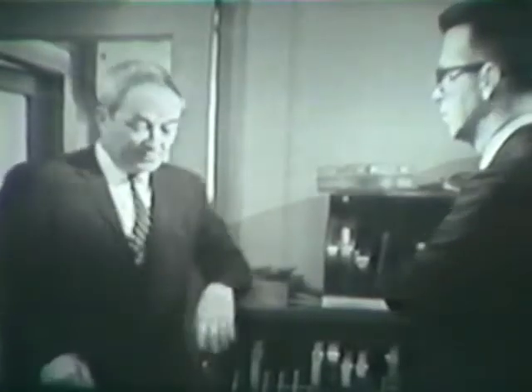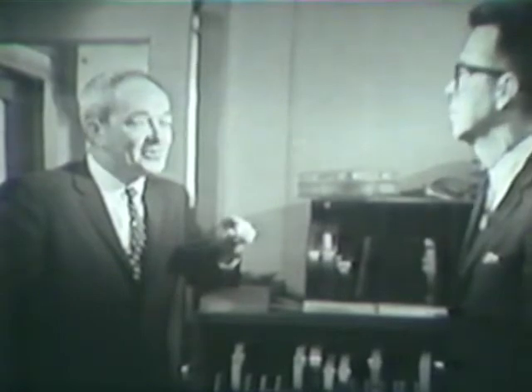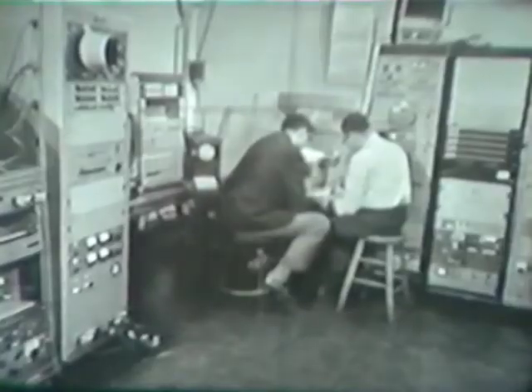And I'd like to show you an experimental system that we have, which will have a spelled speech output. It'll recognize print and speak out the letters. If it sees the word cat, it'll say C-A-T on the output. And let's go over and take a look at it. I think we'll first look at the front end.